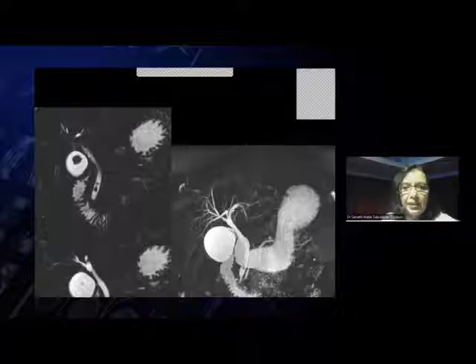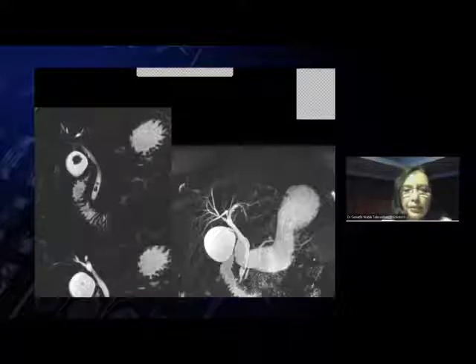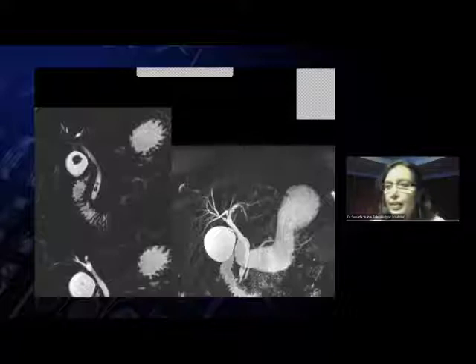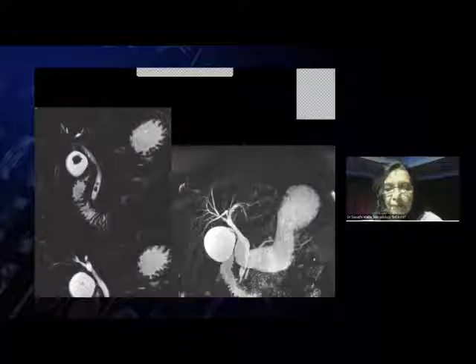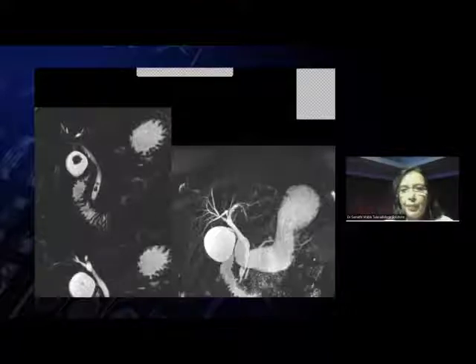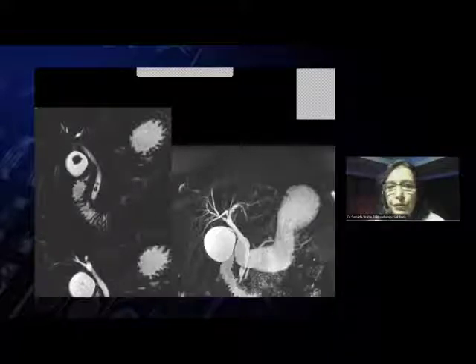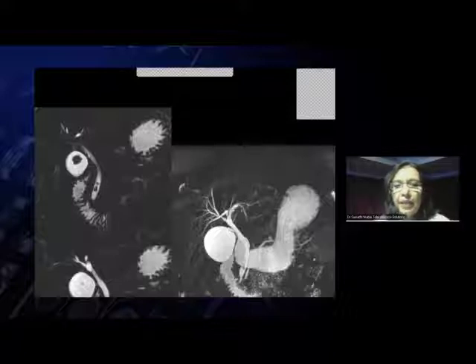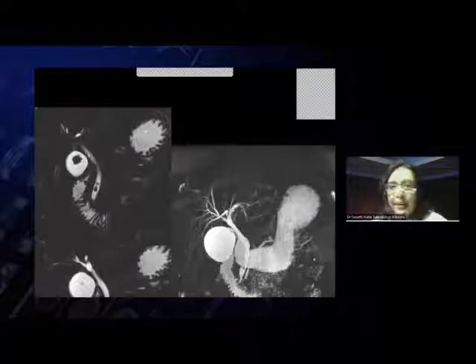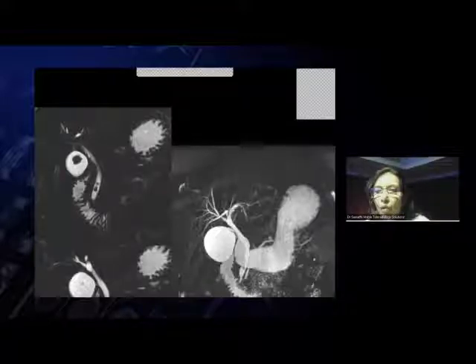Typically, MRCP imaging is done to evaluate the common duct and common duct pathology, mainly common duct stones, as you can see here. Normally, both axial and coronal heavily T2-weighted thin section images are done, typically using single-shot SSFSE sequences or HASTE, depending on which vendor you use.